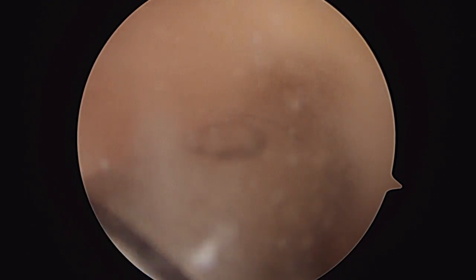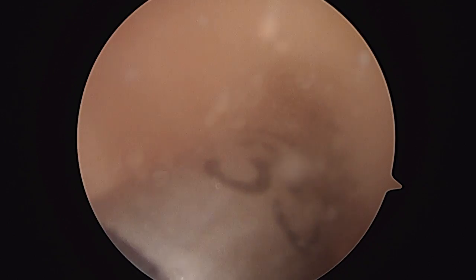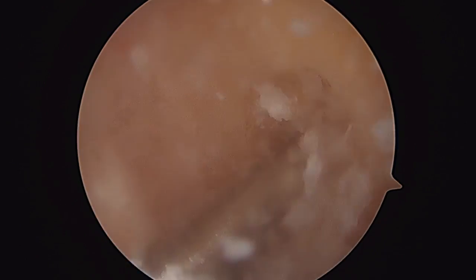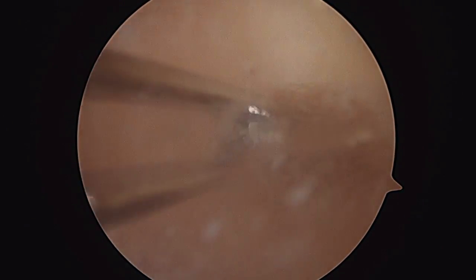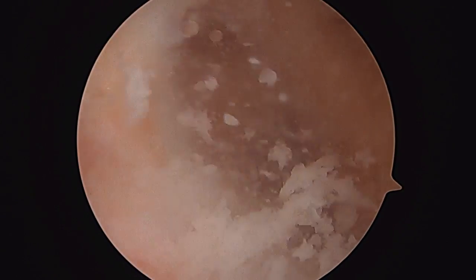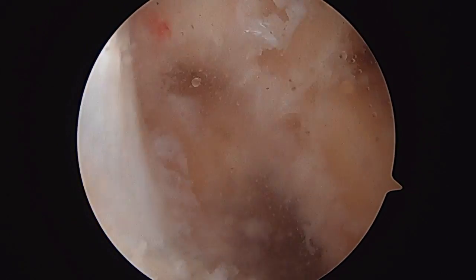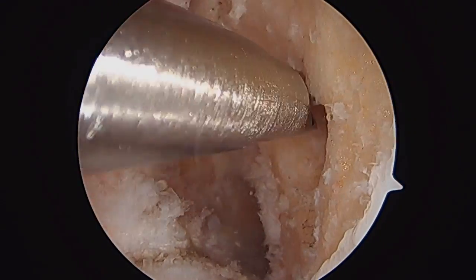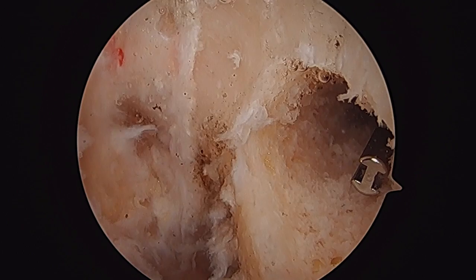I have a 3D CT cadaveric study from the lab that actually proves that this is actually happening with the three-dimensional CT scans and showing the beginning and end results of these tunnels. So again, I pull the guide pin back up into the tunnel to get it out of the way. I can take the knee out of hyperflexion so you can see. We can get a shaver in there. If you're teaching a resident, this is very good to allow them to see what they're doing, to check their progress, to make sure you're not blowing out a back wall and that your tunnel is reproducibly, in every case, in the truly anatomic position.